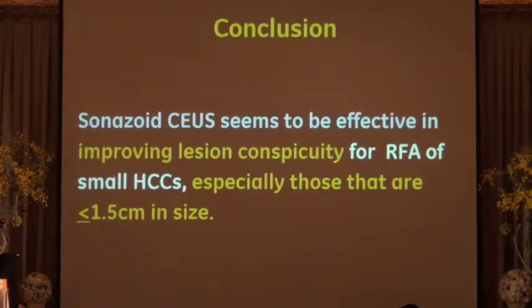In conclusion, Sonazoid CEUS seems to be effective in improving lesion conspicuity for RFA of small HCC, especially those that are 1.5 cm or less in size.